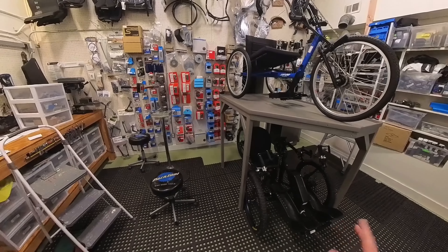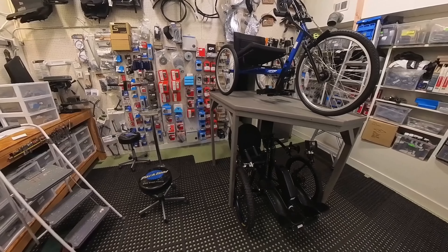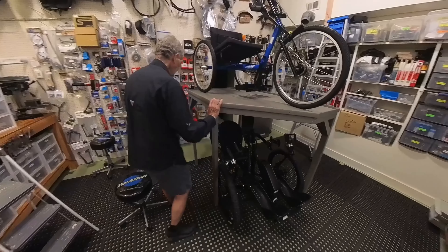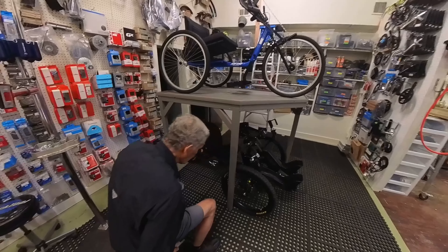Could this also be throttle controlled? This one also has e-assist. Yes, it does. This is the battery in front. This is called a Nuke, and it comes from Crested Butte, Colorado.